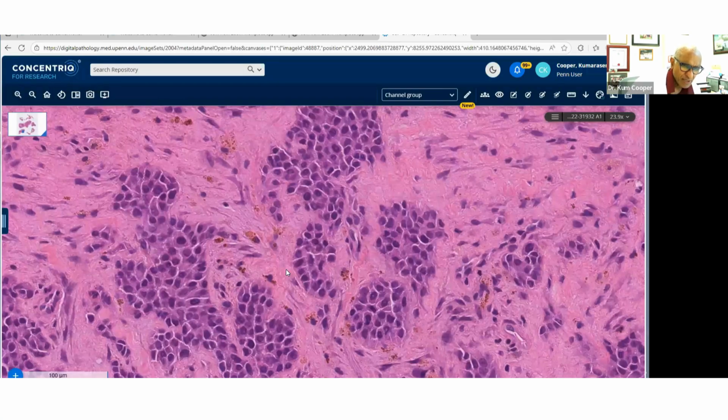Those typically occur in the thoracic spine and are INI1 deficient, but you still need the brachyury. Brachyury is negative here as well. All right. Plasmacytoma, we've done the plasma cell markers. And then, of course, rhabdomyosarcoma has to come into that. Desmin was mentioned. I said it was negative, and that the actin was also negative. Chordoma is coming up again, and again the brachyury was negative.